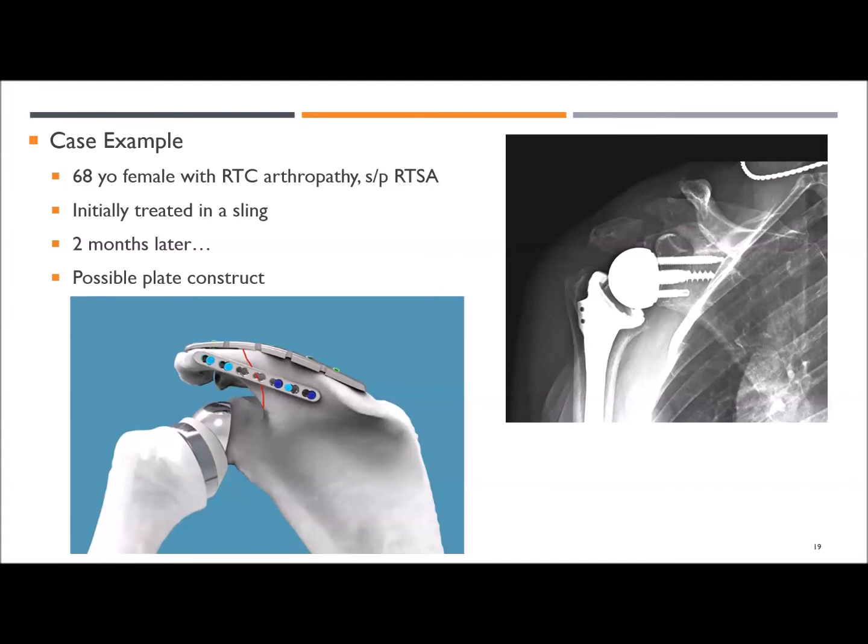I would definitely have a graft, because that acromion bone and the fracture site, there's probably some resorption there. That bone is going to be not good quality at all. This is the type of thing, if you're interested, we could potentially do it together. If you have any interest in that, I'd be happy to. Absolutely. If you're interested. So for sure.